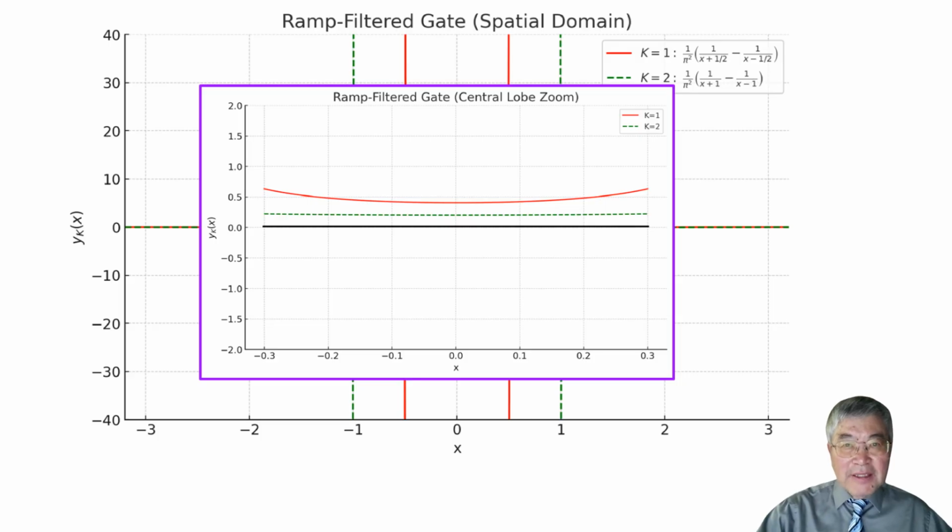And now we apply the same ramp filter to these two cases. The important point is that the ramp filter weights the Fourier spectrum according to frequency. Since the fan-beam case has a narrower spectrum, the ramp filter result is reduced compared with the parallel beam case. In this example, the filter value for the fan beam case is half of the parallel beam case.